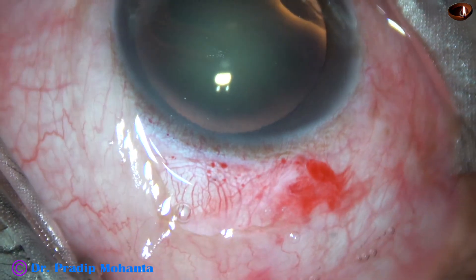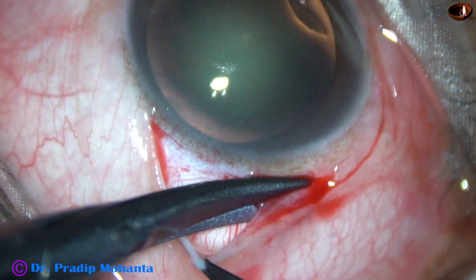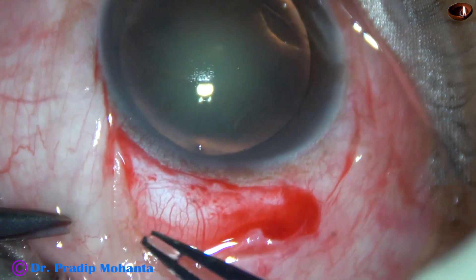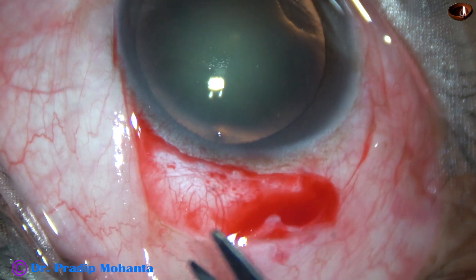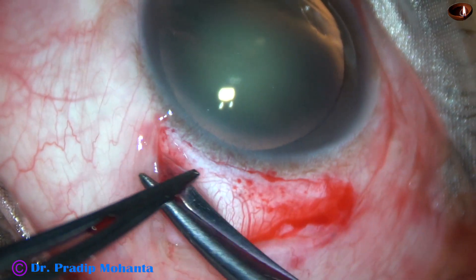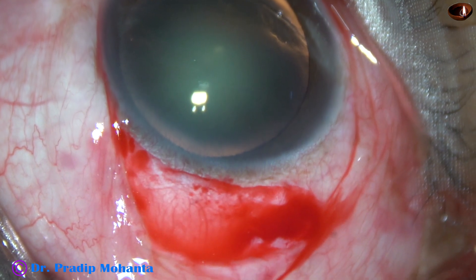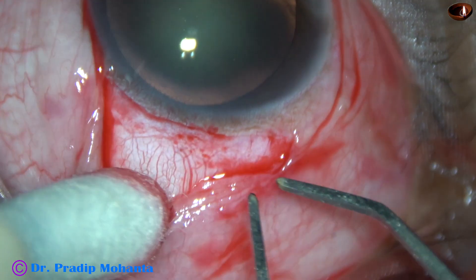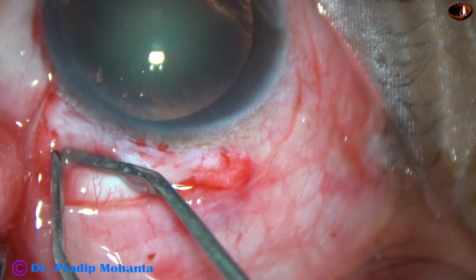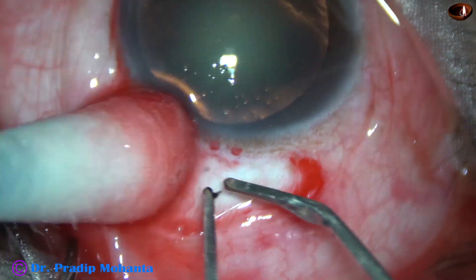From 11 o'clock to 12:30. The sclera must be exposed. The tenon covering the sclera must be managed properly so that the scleral surface is exposed nicely. Once the scleral surface is exposed, bipolar wet field cautery is done very mildly. There should not be any contraction of the scleral surface — very mild cautery is done.